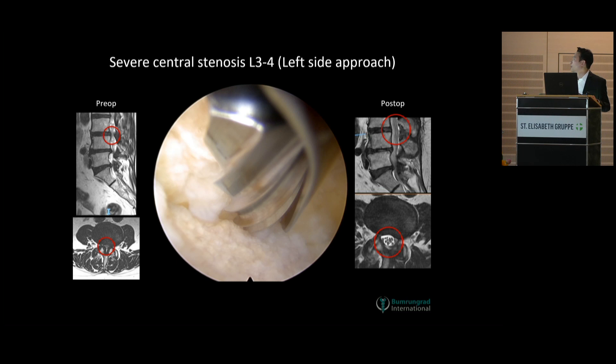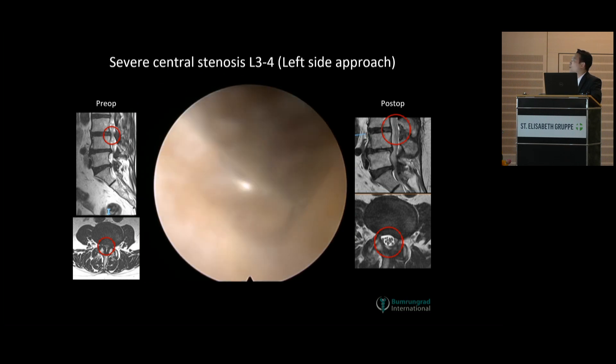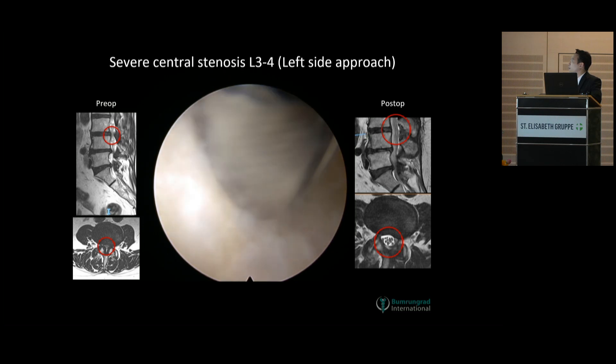We always start from the tip of the descending facet. The key point here is to clean and prepare all the soft tissue — the ligaments, the muscle — and see the clear bare bone before you start the drilling. So you avoid having a lot of debris so you can continue your bone drilling without any problems, and you won't have much bone dust and debris.